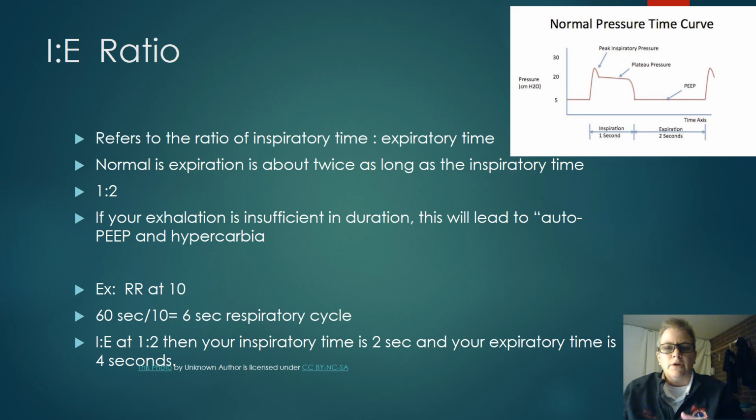Now, if your exhalation is not long enough, if it's insufficient in duration, this leads to them not being able to get all the way down to the bottom of their exhalation, and this leads to auto-PEEP, which causes hypercapnia and hypercarbia. This is not what we want, especially with our obstructed patients. We have to give them sufficient time to exhale.